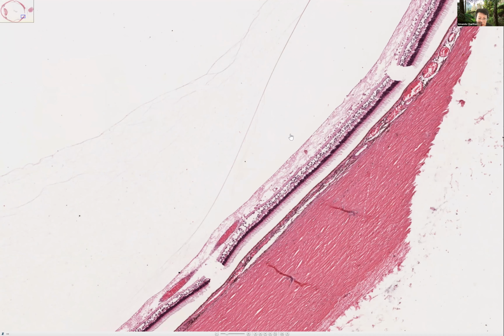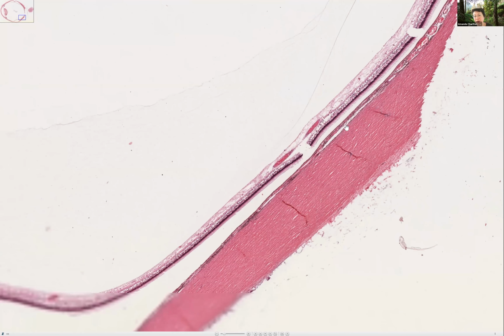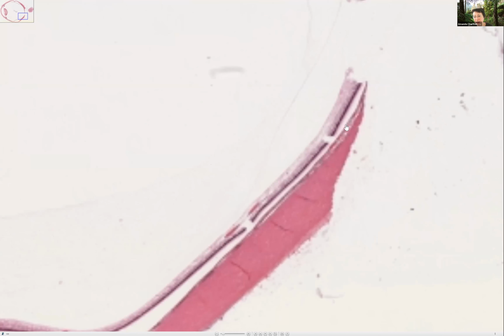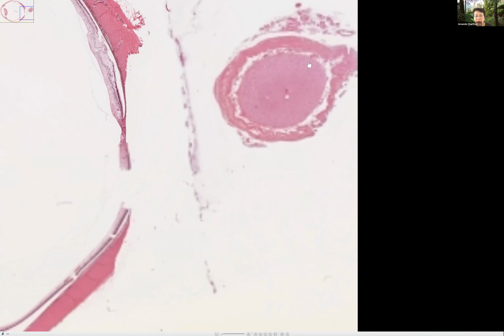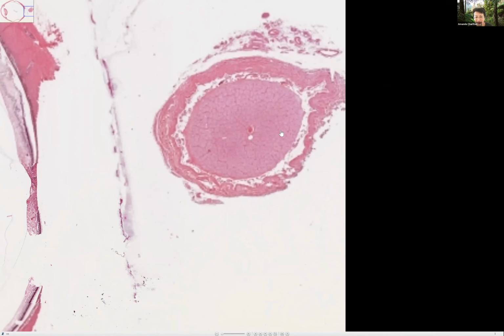So I'm thinking, could this be a vascular cause? Something that's caused preferential damage around the area of the macula close to the optic nerve head. Could this be an ischemic event such as a central retinal artery occlusion? Let's go and have a look at the central retinal artery. So when that renders, so optic nerve, coverings of the nerve. Conveniently, it's been put in transverse section. So we have retinal artery and vein in the center.